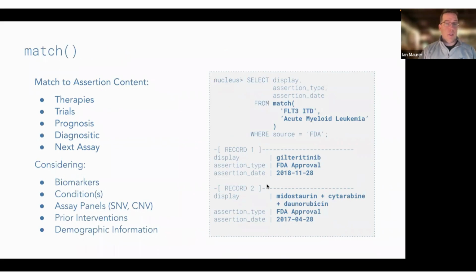And then there's the match capability as well. So once again, you can select data calling our match function, part of the SQL API. This is built into the Postgres database, but it's just basically SQL. So we could port it to other databases as well, and then also work with you to integrate with a data lake as well. And in this case, we're bringing out various drug matches with just a select number of the fields for demonstration purposes.